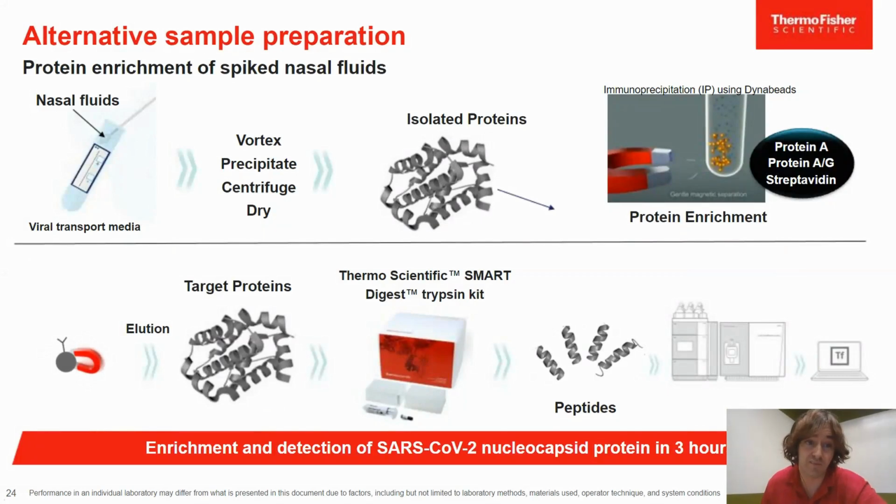So now we've developed our first analogous workflow. We wanted to look into further antibody enrichment techniques, which would target the proteins, so enriching the proteins. To do this, we used an antibody enrichment technique where antibodies are coupled to magnetic beads and used to enrich targeted proteins. In this case, the enrichment step would be placed before enzymatic digestion.